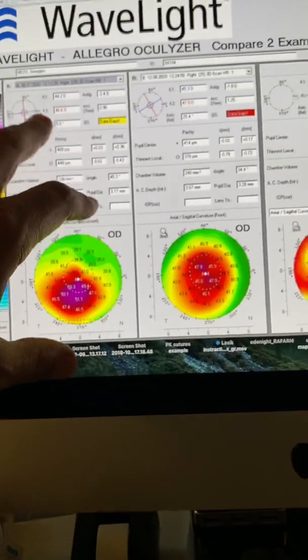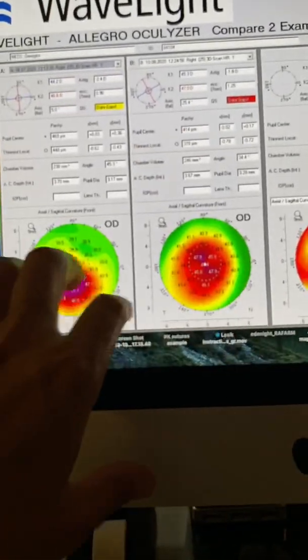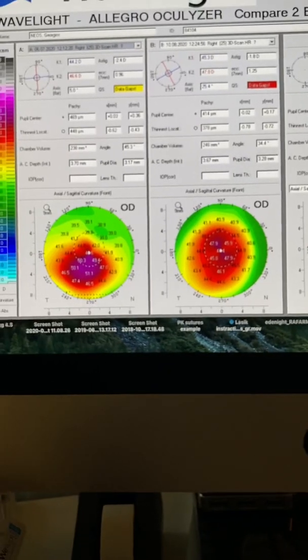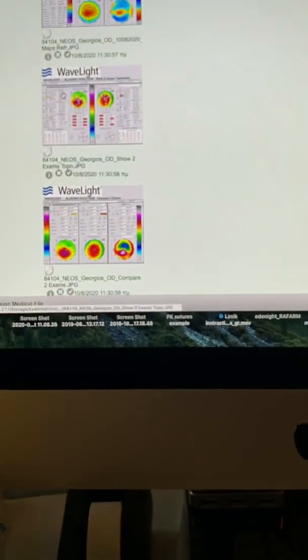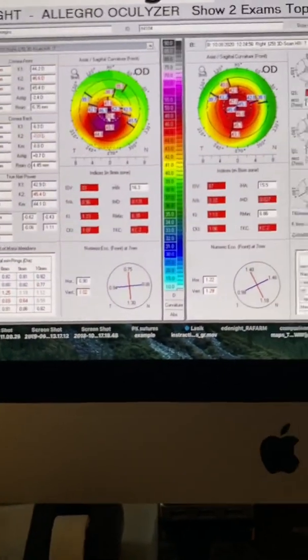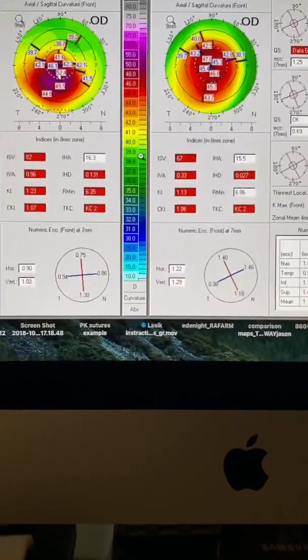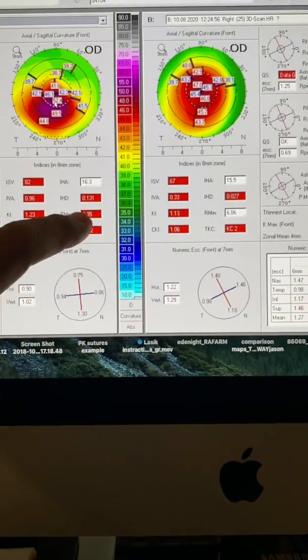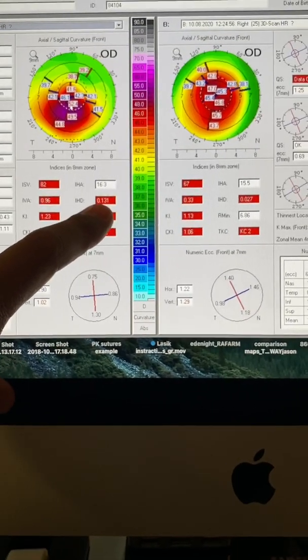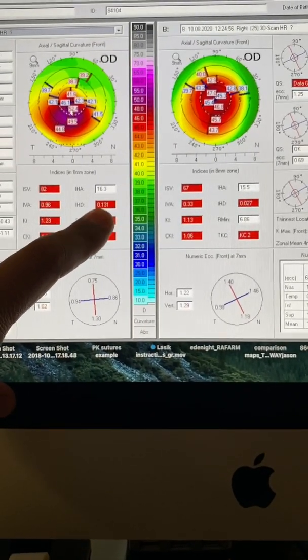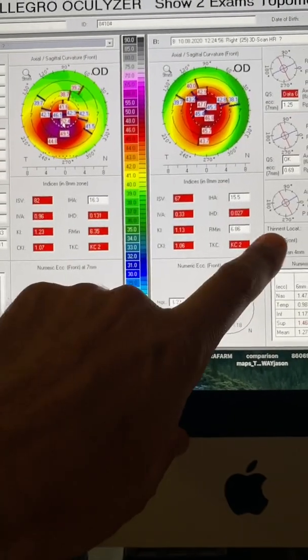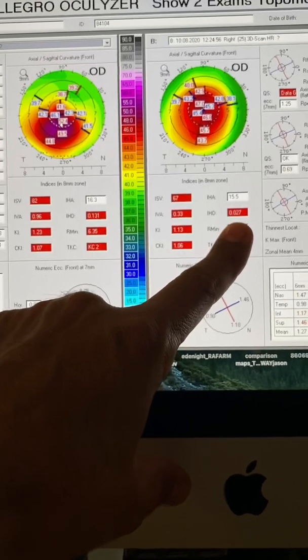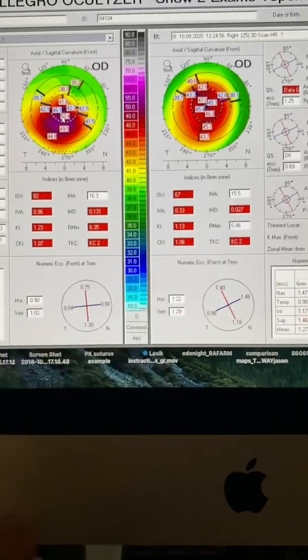And although the keratometries have improved dramatically, let's look at the topometric indices improvement. We've reported and you all know now how we judge these. We go from an IHD of 131 to an IHD of 27. This is miraculous.